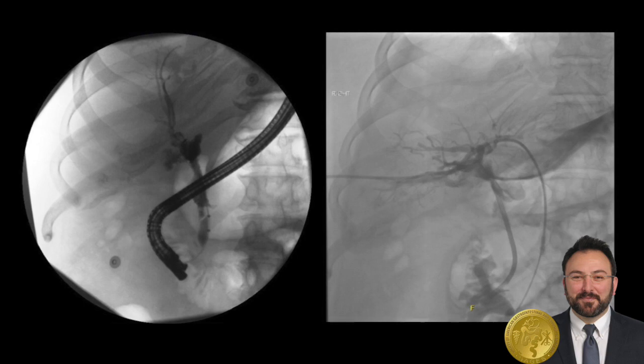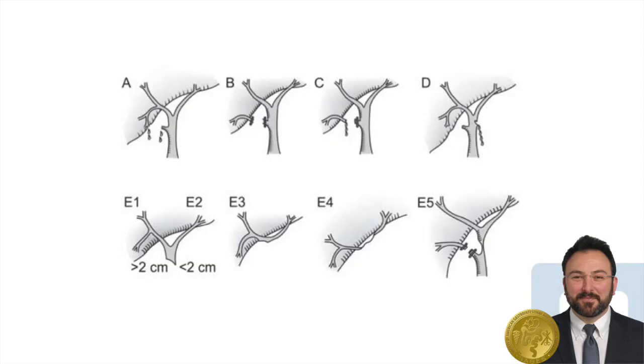A cholangiogram shot post-operatively showed a similar experience, with contrast coming from the liver and the wire not being able to meet up with the bile duct stent that was placed during ERCP. Our concern based on pre-operative studies was an E3 injury at the confluence of the left and right bile ducts.